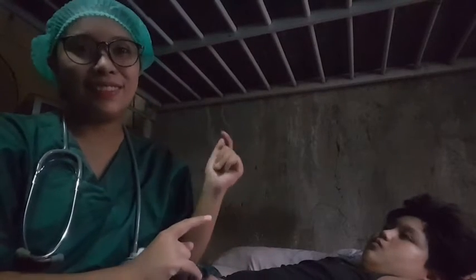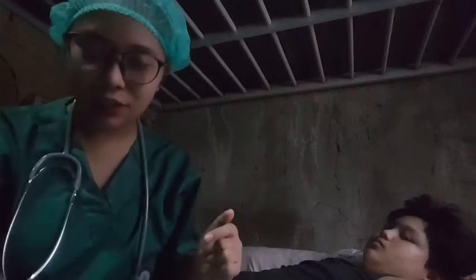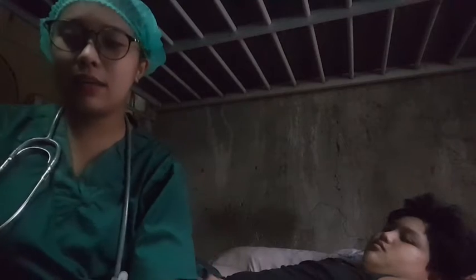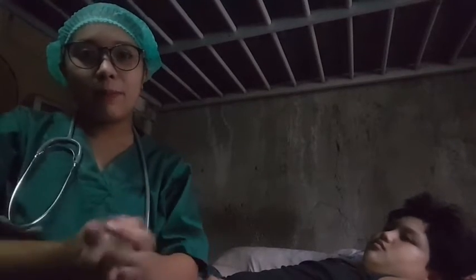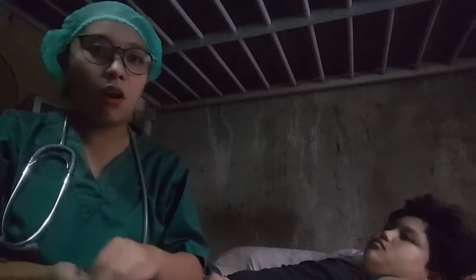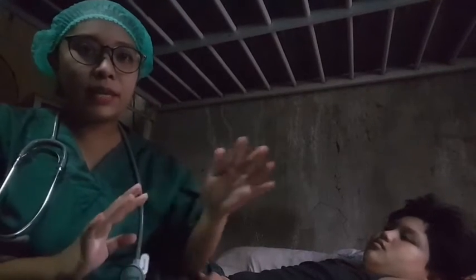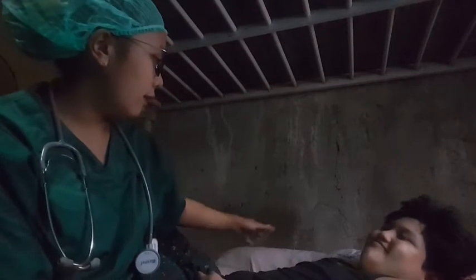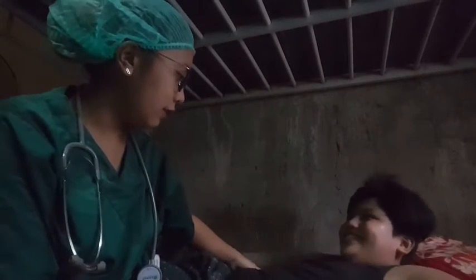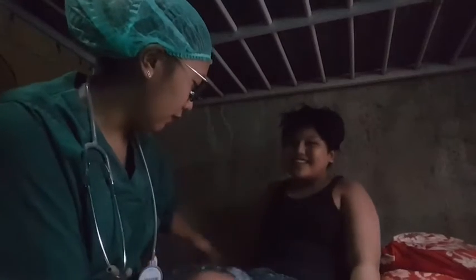Now we continue to perform hand hygiene. I have here my alcohol and my gloves, and put on PPE as indicated. In this case we don't need PPE at all. Place the patient in an appropriate position, semi or high Fowler's position. Would you please go to semi or high Fowler's position? Can you do it? Okay. Great.